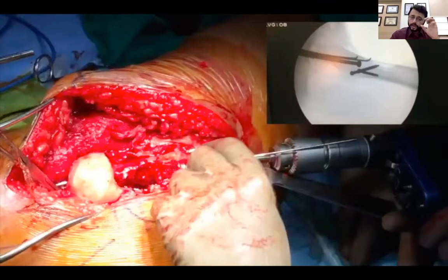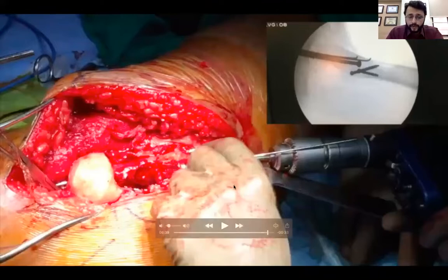Because what you are going to do is, when you reduce and fix the trochanter, you fix it with one drill bit, remove the drill, keep that drill bit in place, and then drill the other side, and then put the screw. So if you have to drill it and remove the same drill bit, it's not going to work because you are going to miss that hole. And this is after a very long, tiring surgery of about 3 hours. And you are going to be really frustrated when you are trying to fix that trochanter. So see to it that you have two drill bits and long 3.5 mm screws.